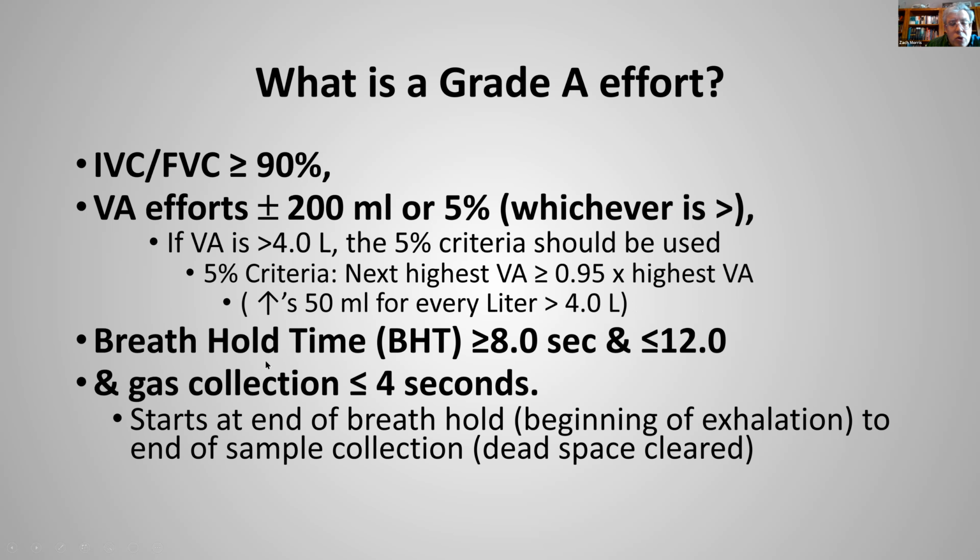Breath hold time, the third criterion, must be greater than or equal to 8 seconds and less than or equal to 12 seconds to be acceptable. And gas collection, the fourth criterion, needs to be less than or equal to 4 seconds. These are the four criteria for an A test. As I told you, this starts at the end of the breath hold, the beginning of exhalation, to the end of the sample collection when you've cleared your dead space.